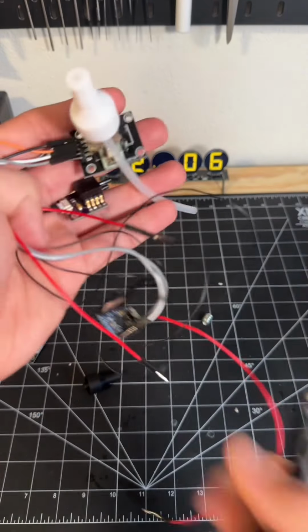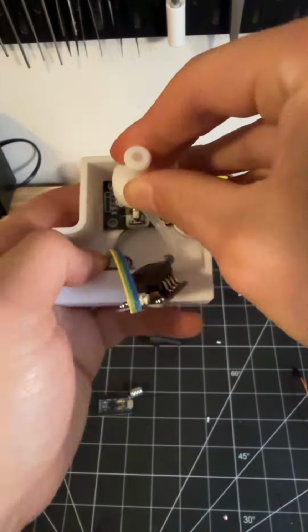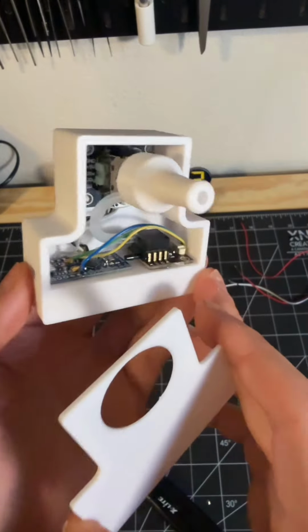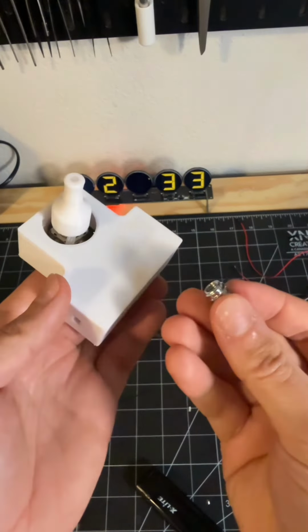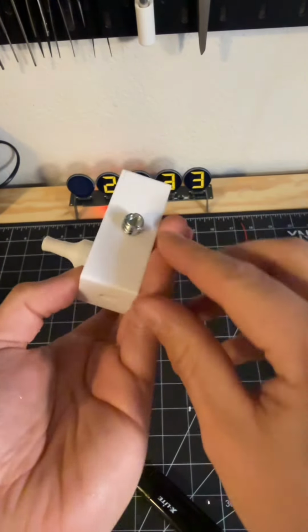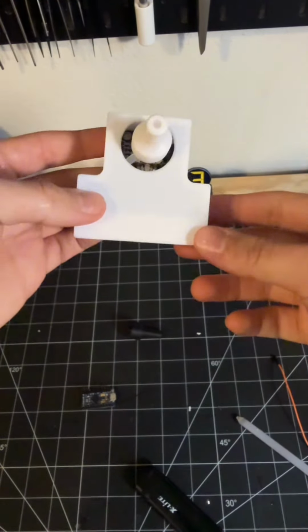Now I just need to get my soldering iron to clean up the wiring here. Now that we've got it all cleaned up, let's fit it into the case. That all fit very nicely. Now just our little front plate that clicks on, and we are ready to rock. Actually, one more thing. I have this little threaded insert that'll allow me to use this with a standard tripod screw. Now I can mount this pretty much anywhere I want.